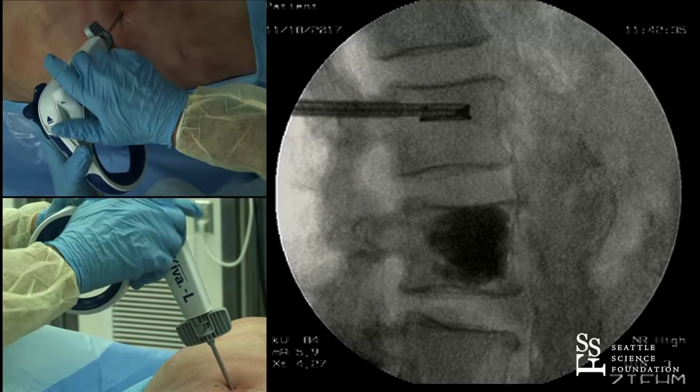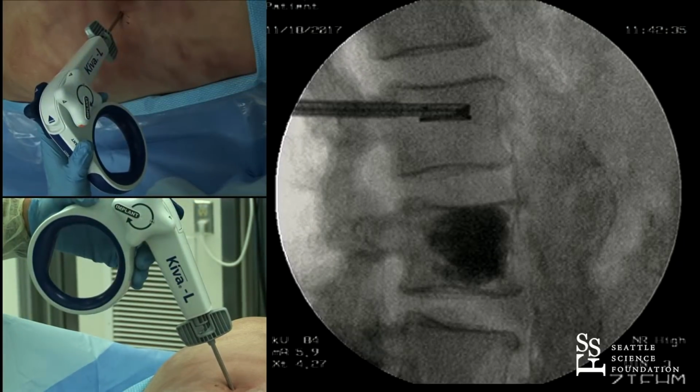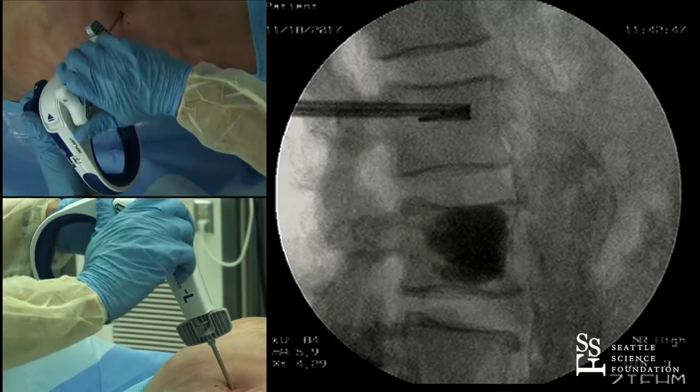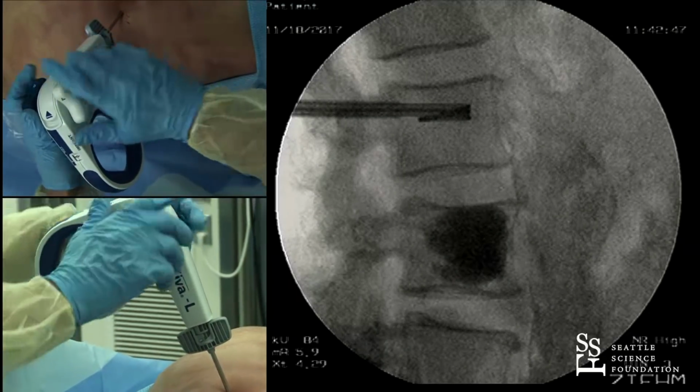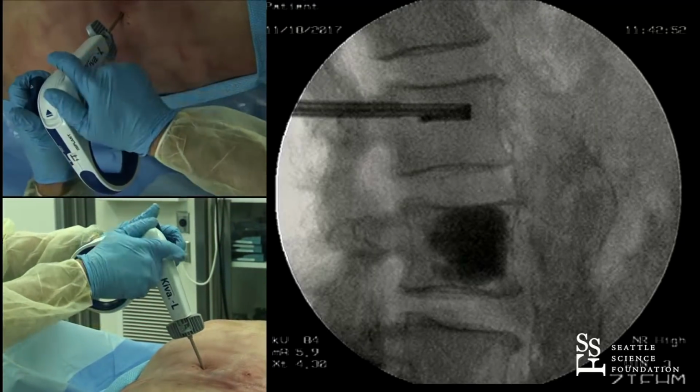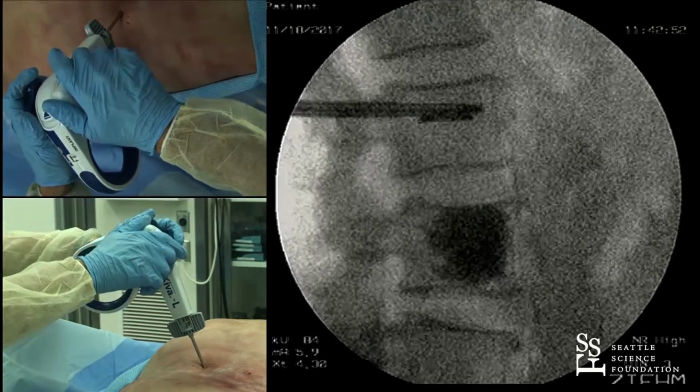As the implant goes out, you'll start to see it is PEEK, so it's radiolucent, but it has a radiopaque distal tip. All right.